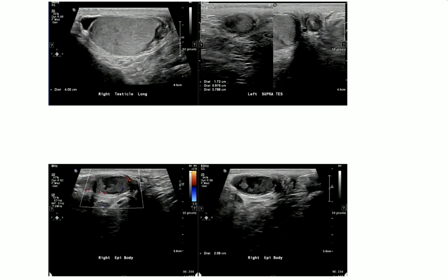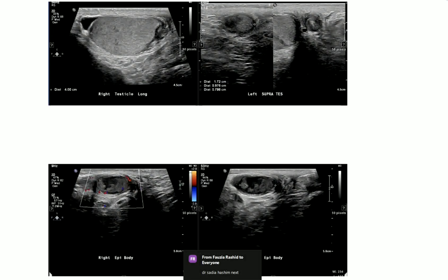These are the spot images from ultrasound examination. The right testicular parenchyma itself is appearing normal. There is no evidence of any abnormal heterogeneity of its parenchyma, no evidence of any lesion within the substance of the testes itself. Coming up, I would note the vascularity showing within the rest of the parenchyma.